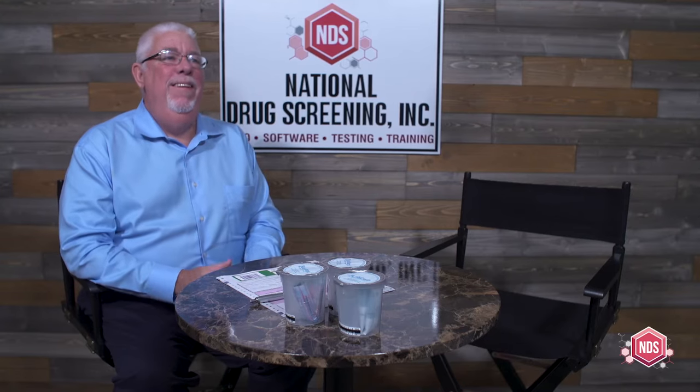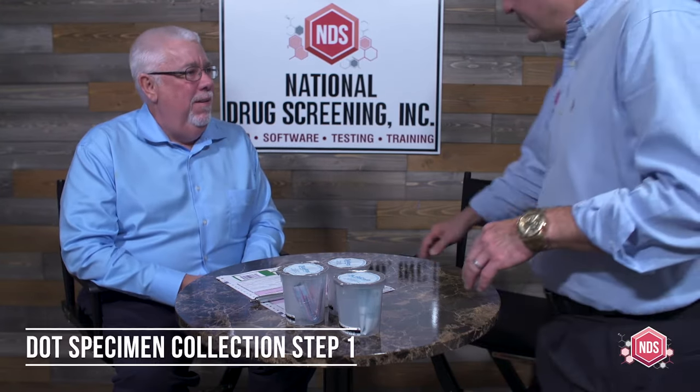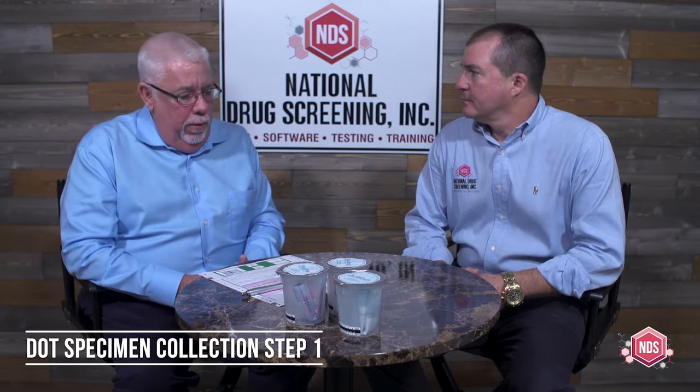Come on in. How are you today, sir? I'm doing very well. How about yourself? Good. Are you here for your DOT drug test? That's correct. I'm Joe Riley. I'm going to be your specimen collector today. I just want to go over a little bit about the DOT drug test that we're going to be doing today.